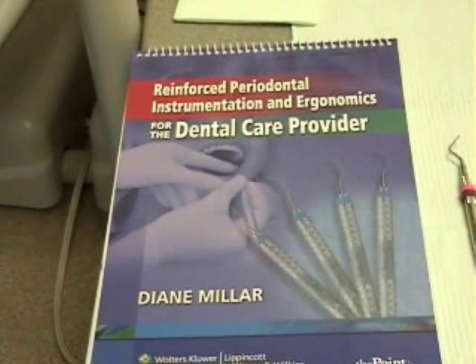This video is covering advanced instrumentation techniques. First, it must be clear that traditional techniques for periodontal debridement, such as ultrasonic scaling and hand instrumentation, should be utilized initially. When root morphology and disease conditions make access to deposits impossible with traditional instrumentation techniques, advanced instrumentation techniques can be utilized. Advanced instrumentation techniques will be the focus of this video.